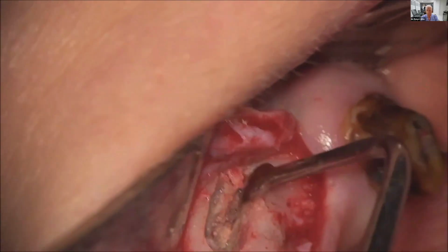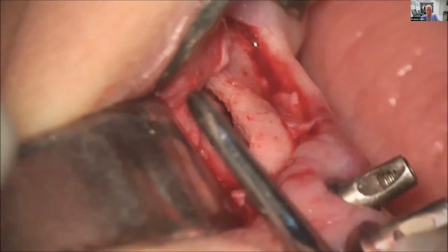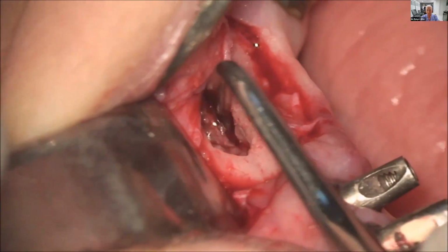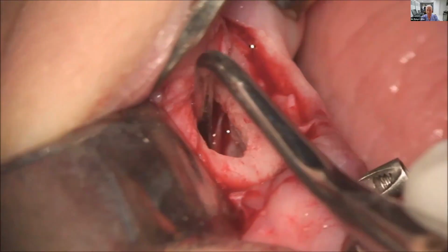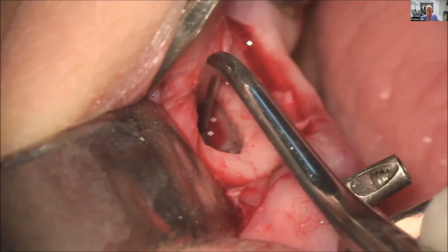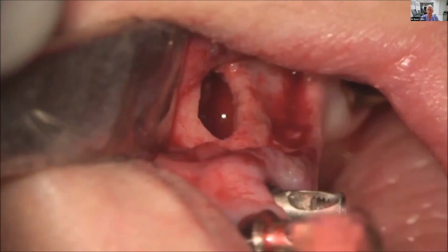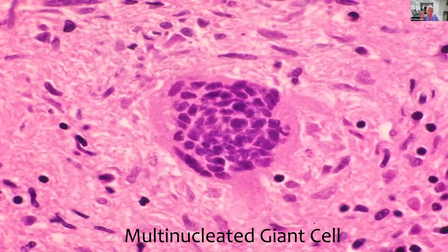All right, so the clinician had decent surgical skills to be able to do the sinus graft, but used the wrong material. So I'll re-raise the sinus membrane, and then I'll choose a graft material that will completely resorb, and then additional posterior implants can be placed. This is the multinucleated giant cell. This is the reason why you get connective tissue rather than hard tissue.